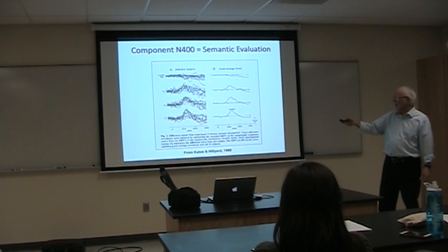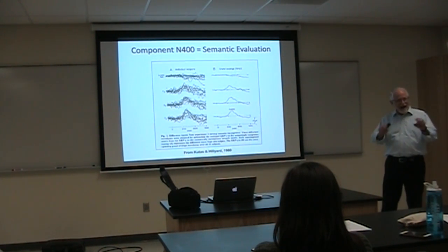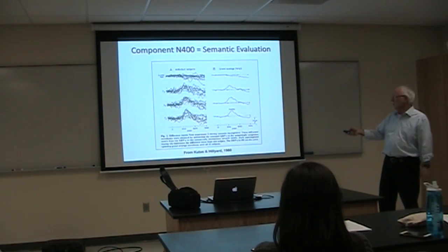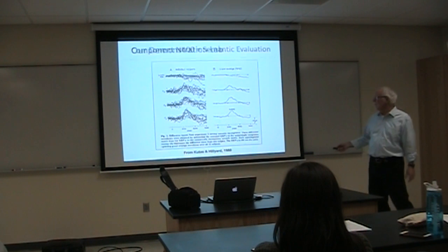And then we plot that for each of the 12 subjects, and it's kind of a mess. But then if you do the grand average across all 12, the average across all the trials for each subject, and then average all the subjects, you get something that really shows the N400 as a distinctive waveform component.